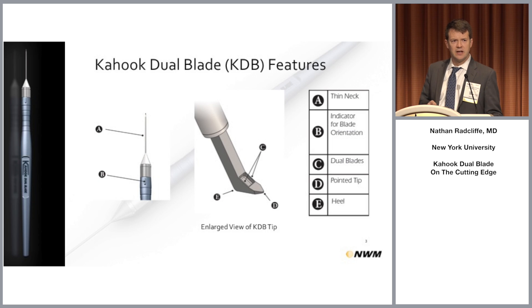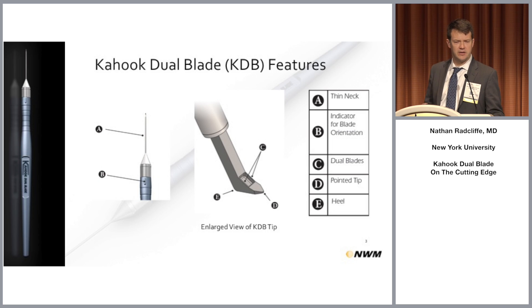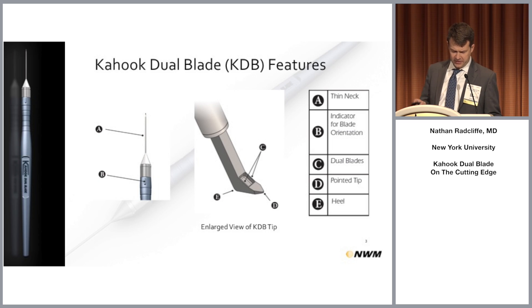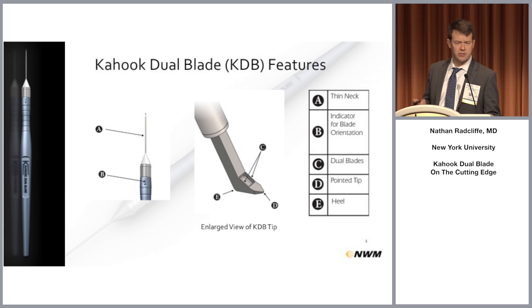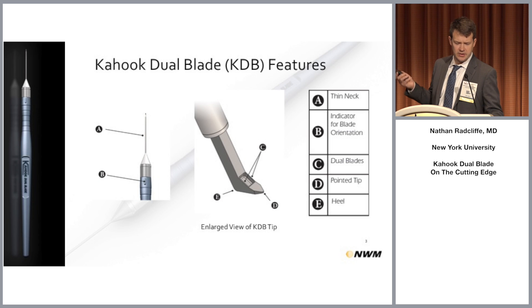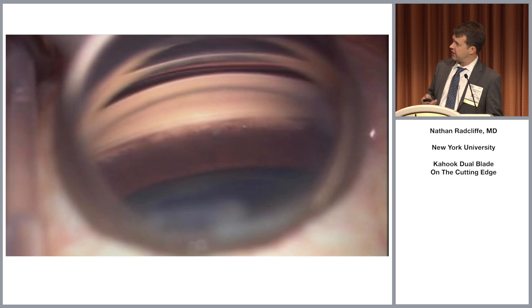If you're managing glaucoma, gonioscopic visualization is a technique you want to have in your tool bag because many implants and other techniques depend on that skill. Here's a video — we've already got a view of the trabecular meshwork and the canal of Schlemm through standard intraoperative gonioscopy. There's viscoelastic in the anterior chamber on the corneal surface, and we're using a Swan-Jacobs or similar model gonioscopic lens.